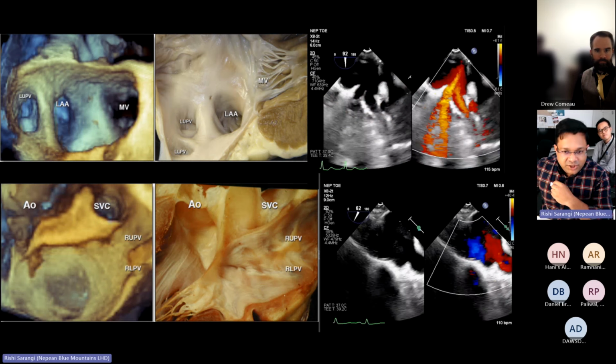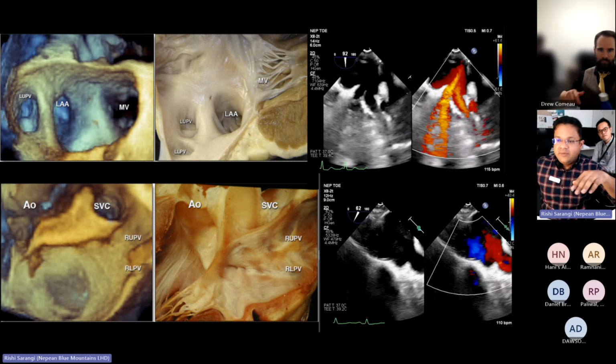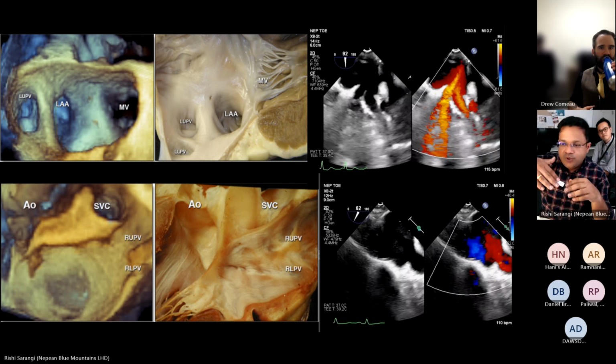And this is how the picture looks. So what we have done is I was in the four chamber view. Then I usually use a color box to guide me to see where the pulmonary veins are entering. After that I start rotating the probe anti-clockwise and move my handle as well at the same time. I'm looking at the extreme left, towards maybe the 1 o'clock position, based on how the probe position is.